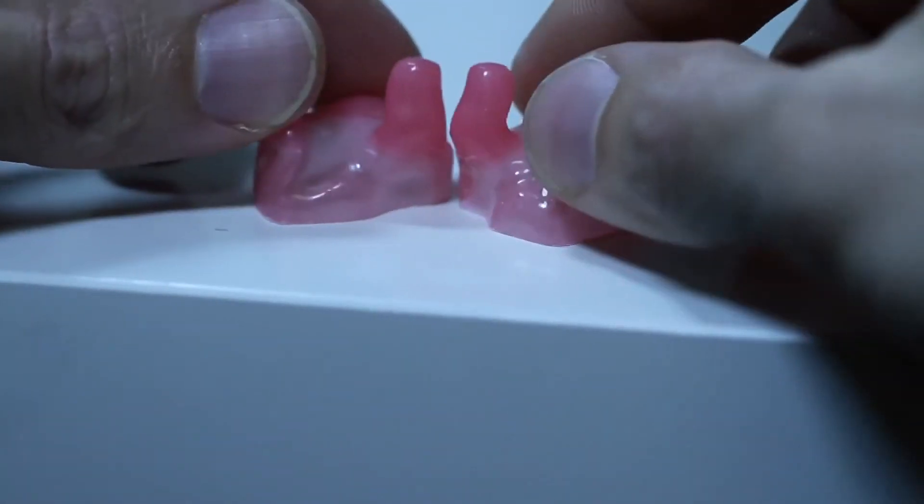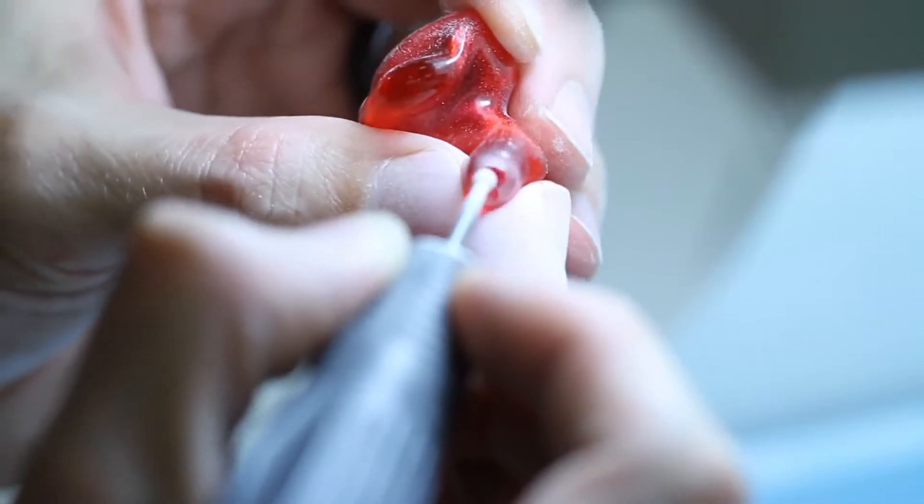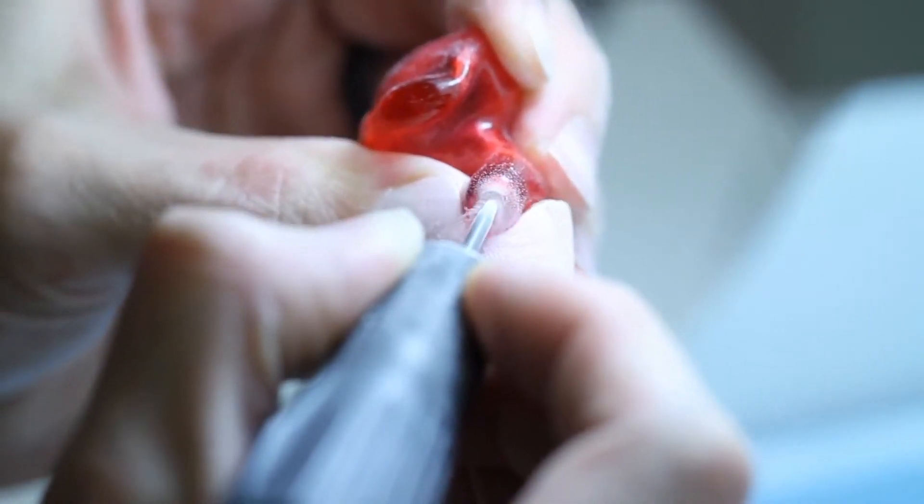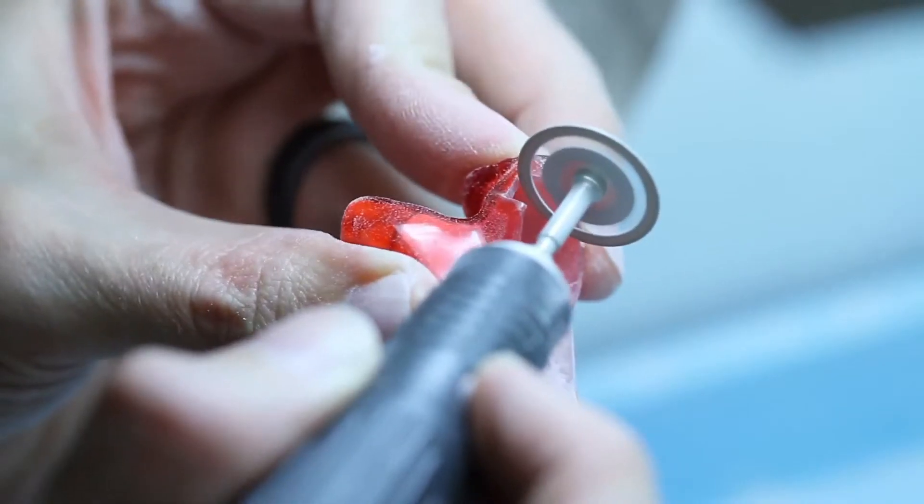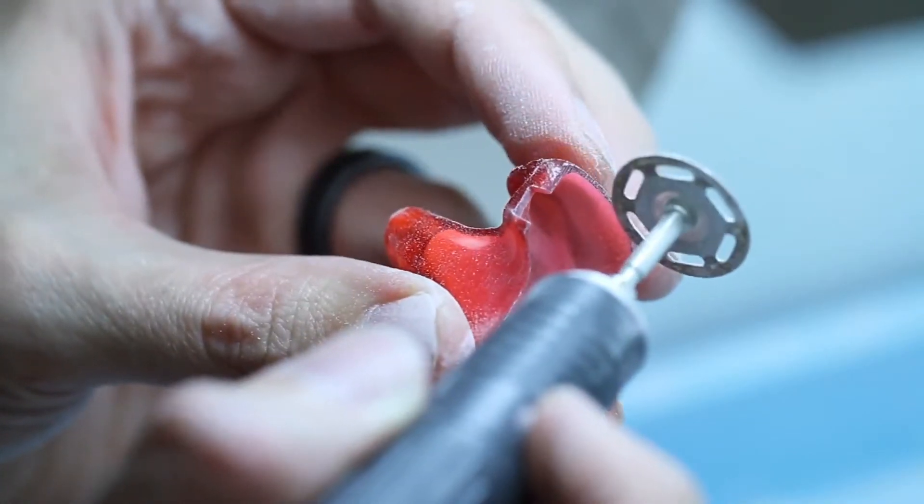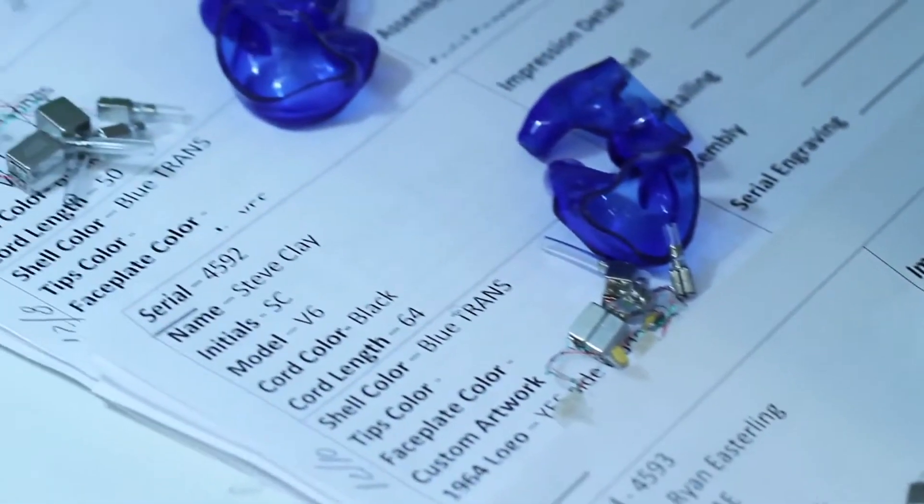After the shell is made, it also must undergo some trimming and detailing before it's ready for assembly of the components. We drill the appropriate notches and channels for the sound tubes and cable sockets. When the shells are ready, they go into the assembly area.